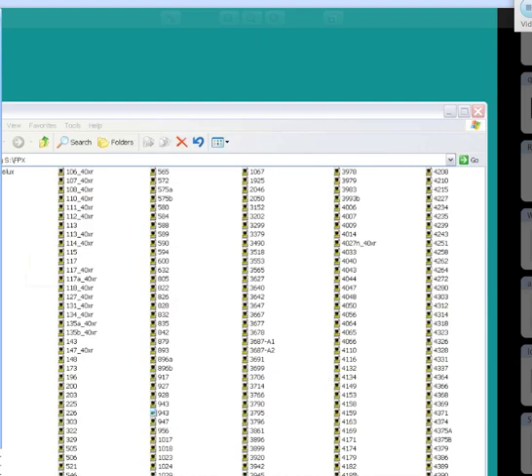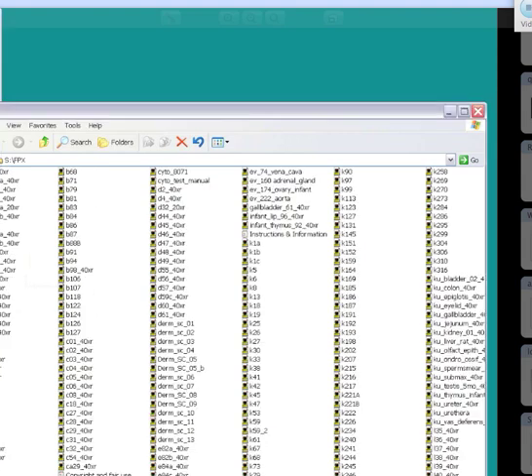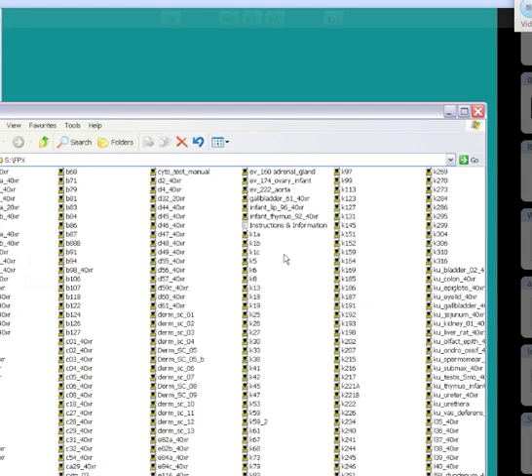Uh-oh, what happened to 4001? Oh, don't tell me I screwed up. Hold on, let's look at it a different way. Maybe we've got another way of looking at the appendix. Where's my appendix here? Well, guess what, folks?